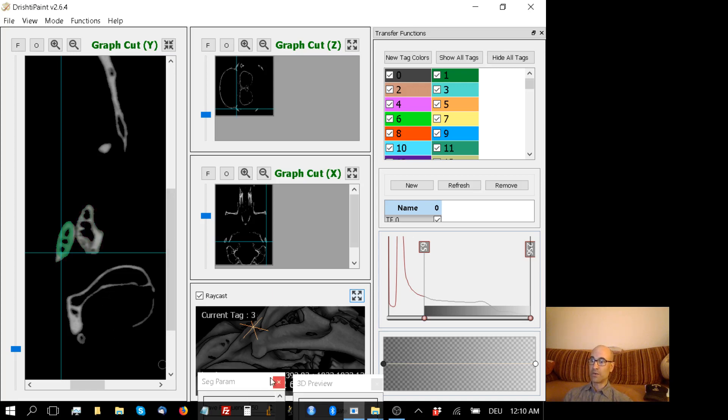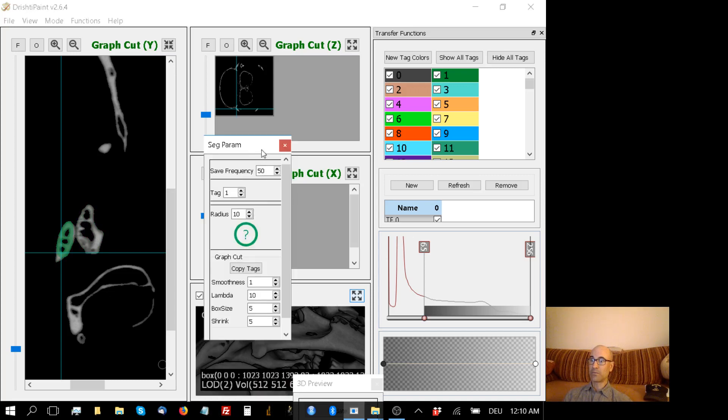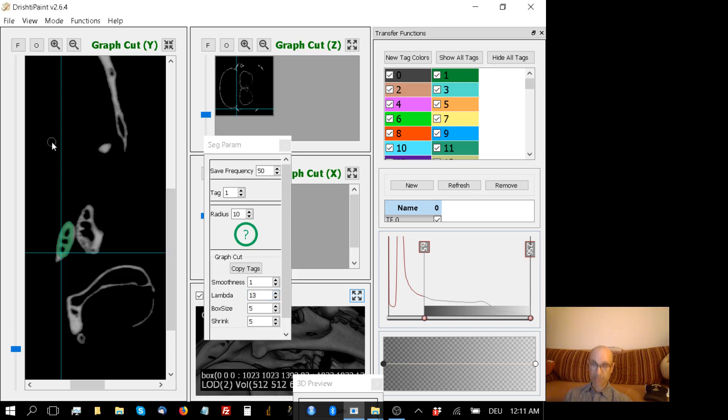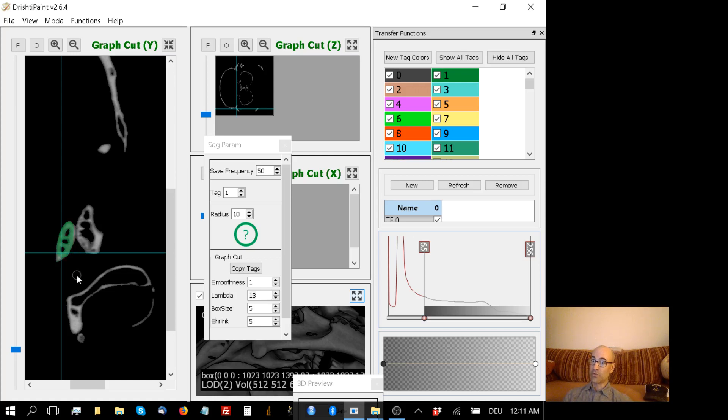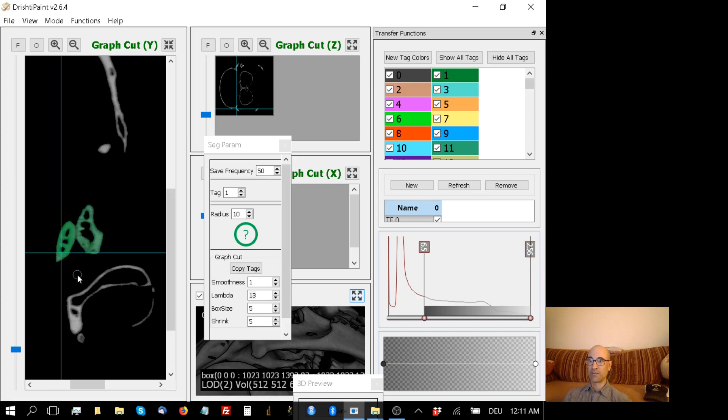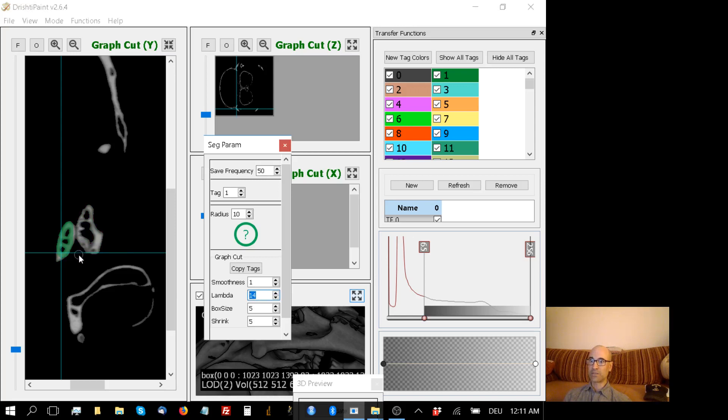What I need to do now is go to my segmentation parameter window, and by adjusting this lambda - you can do it with the other things as well, but I'm going to focus on lambda for now - if I increase that to, say, 13, and I try again, click again in my Y box, I hit T for tag, it's a bit more picky. It didn't cross that barrier. So I can do this slice by slice. I use the arrow key right there. You can also use the mouse wheel. I'm going to hit T again. And unfortunately, I need to make it less sensitive. So I hit R to remove the tag. I'm going to increase lambda by another notch. And let's try this again.